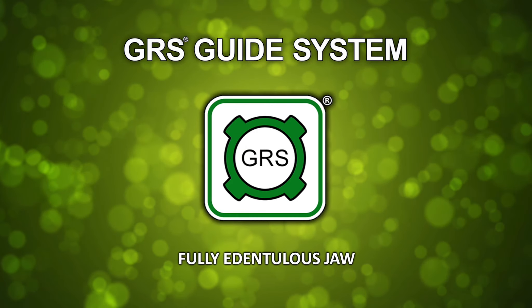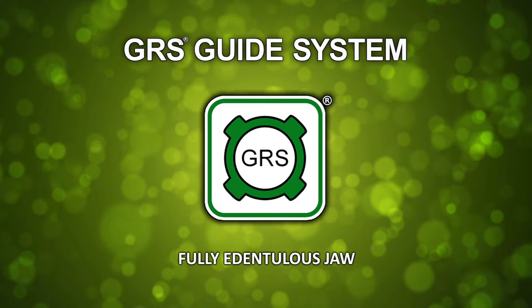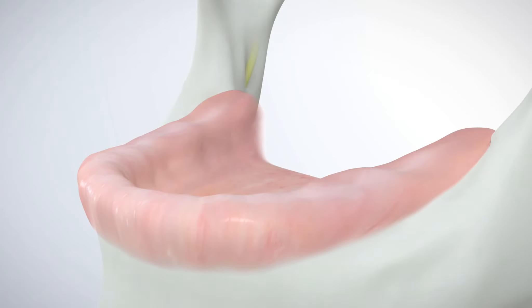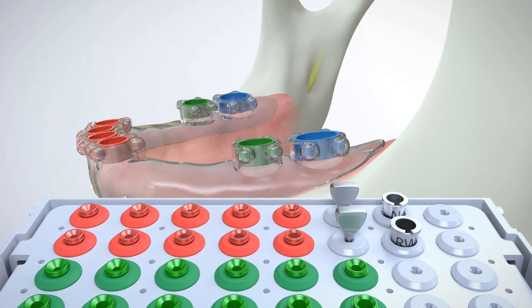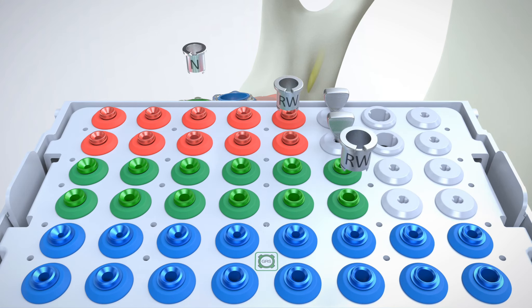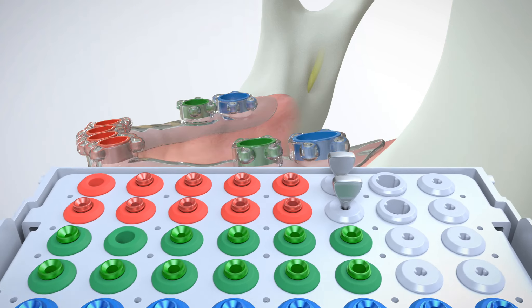GRS Guide System — fully edentulous jaw. A GRS surgical guide may also be secured to an edentulous jaw with the use of fixation screws. Completely edentulous surgical guides can be vacuum-formed, 3D printed, or milled. Depending upon the implant type and platform, several GRS drill sleeves with the same or different diameters are removed from the cassette using GRS IR tools.